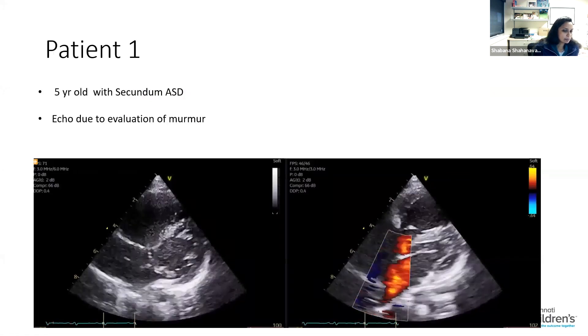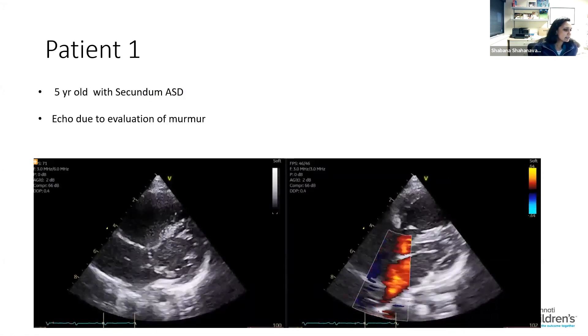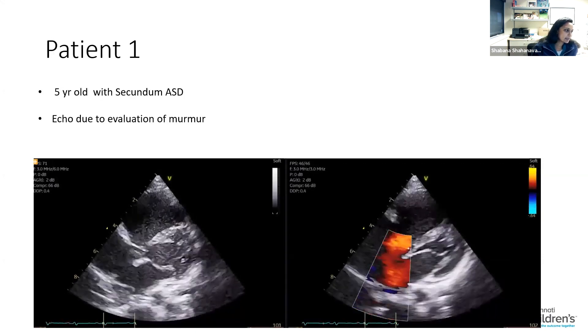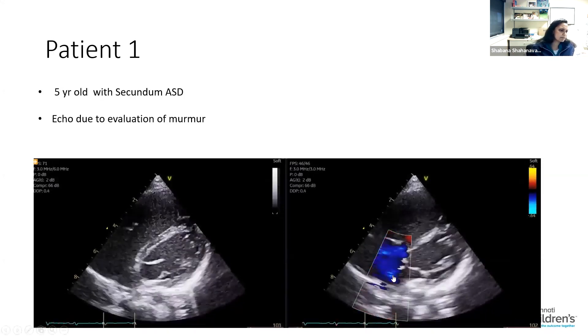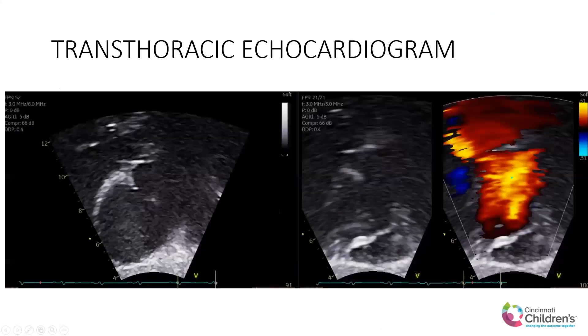I'll go on to one case and then push it back to Matt. This was the five-year-old with the secundum ASD. This is the transthoracic echo — almost an apical two short axis picture where the AV valve rim looks okay. The right upper pulmonary vein, not the best in that projection.